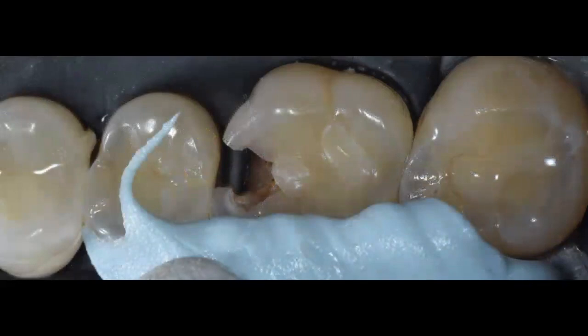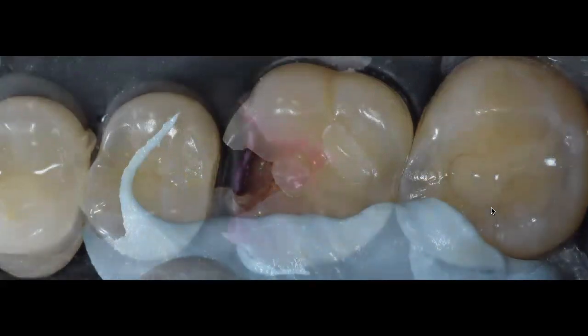You can see that I was able to just squirt some bite registration material, any brand that you use in your office, a little bit on the buccal, a little bit on the lingual. You do it in two separate steps. I'm showing you only the buccal here, but I did the same for the lingual, and then you put those aside. Once this PVS sets, just put it aside, and then you go back and start working on your preparation.